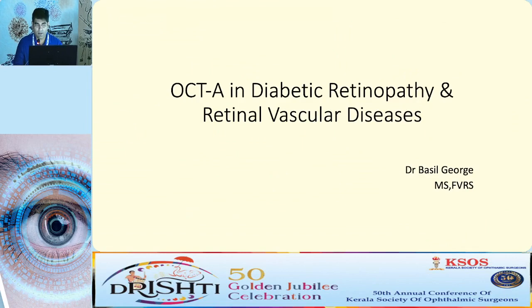So today I'll be talking about OCTA in diabetic retinopathy and retinal vascular diseases. Basically, OCTA is not a diagnostic tool for diabetic retinopathy, but it helps in supporting our diagnosis.